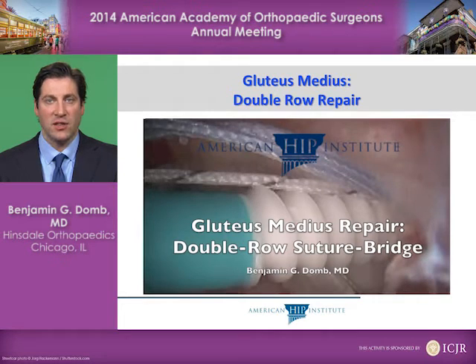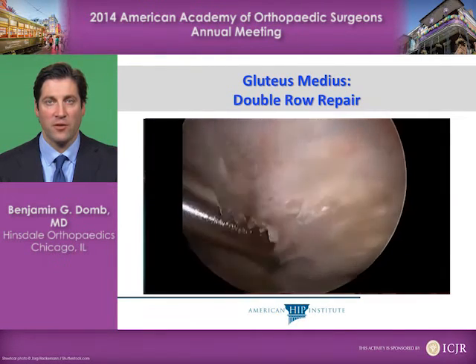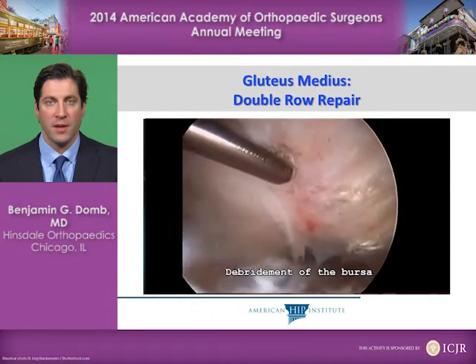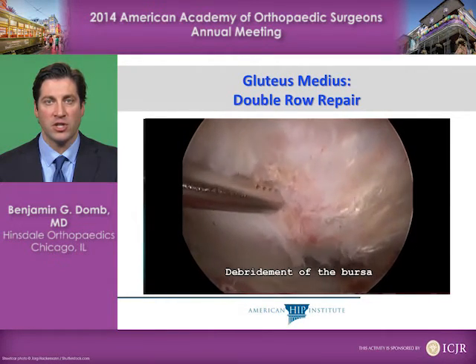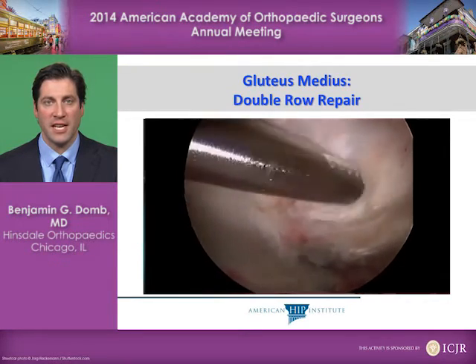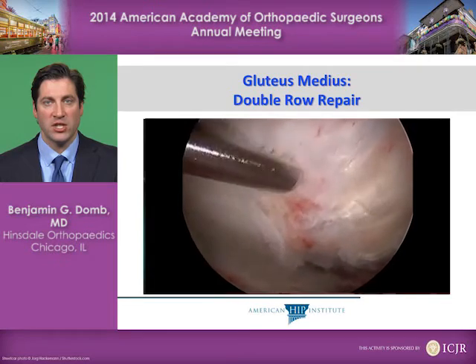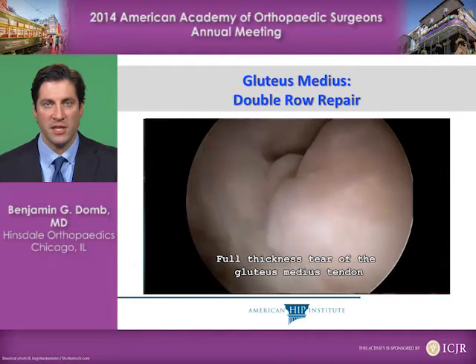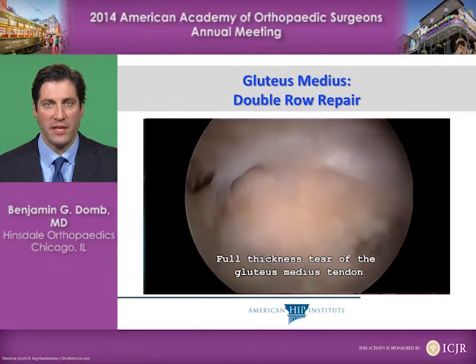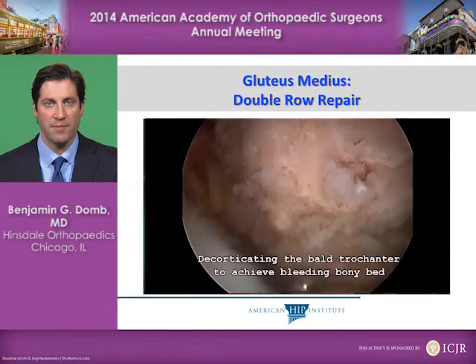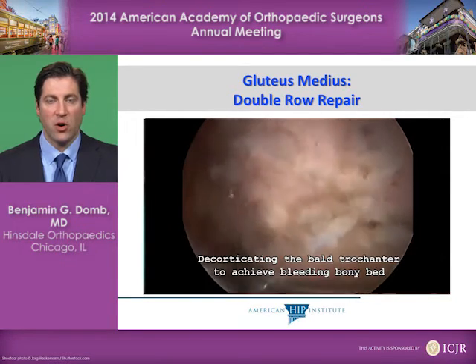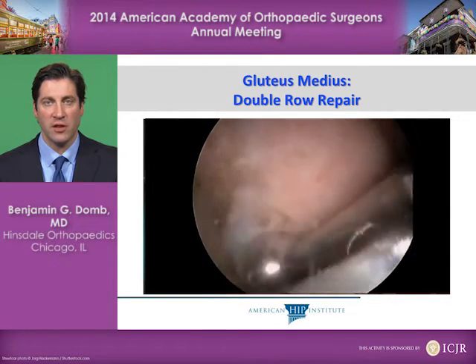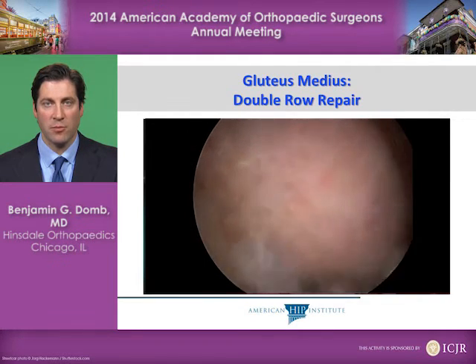A very different entity is the full thickness tear of the gluteus medius. For this particular entity, we'll begin with a debridement of the bursa once again. After we've debrided the bursa, we'll expose a very large tear in this case with a retraction of the tendon away from the bone. This is essentially a bald greater trochanter. You can visualize the tendon, and as we retract it, we see that the entire greater trochanter is bald, with enthesophytes from the chronicity of the tear on the trochanteric tip. We'll decorticate the greater trochanter to achieve a bleeding bed of bone, and note that the footprint of the insertion of the gluteus medius is very large.